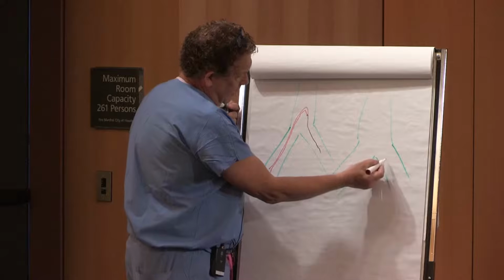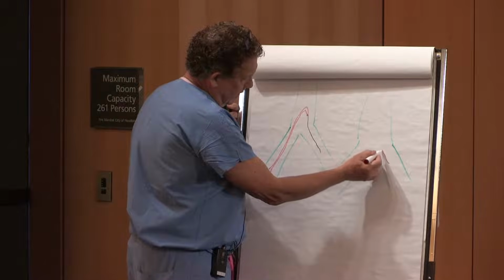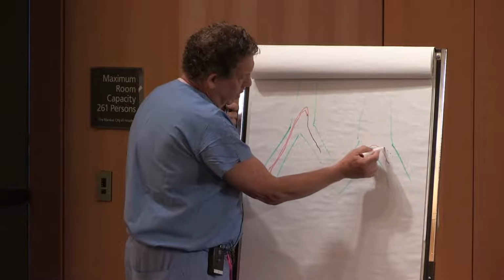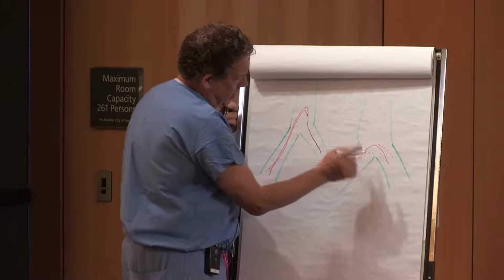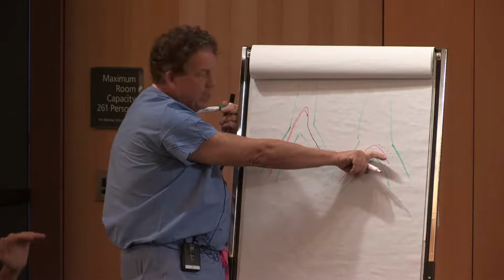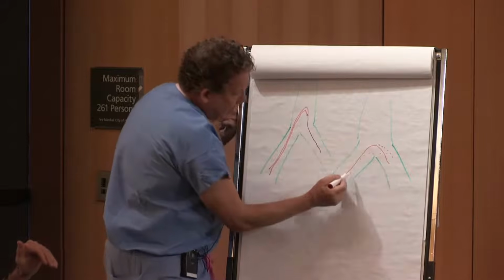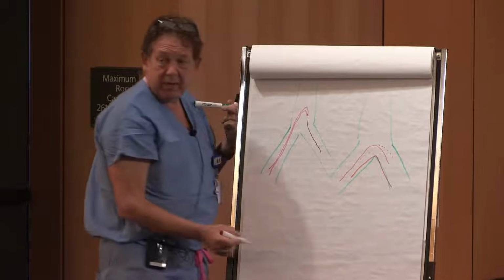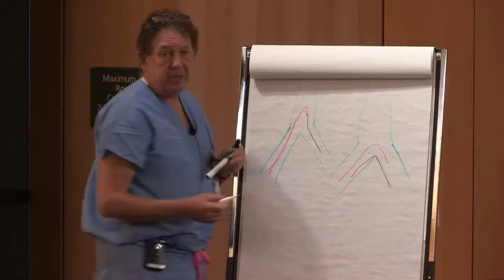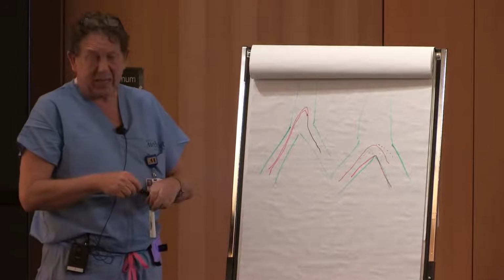The red is the catheter. So the catheter will be sitting down like this. You'll pull it back, and as you do that, the tip will come like that. We know we're set on the bifurcation at that point, and then you push the thing back in a little bit. At that point you know this is sitting right like that, and it gives you a lot of pushability. Now you can advance that wire down the other side. You get to practice, because those glass models are remarkable.